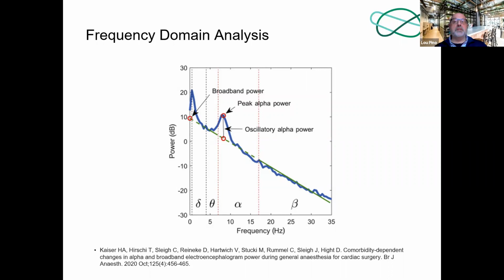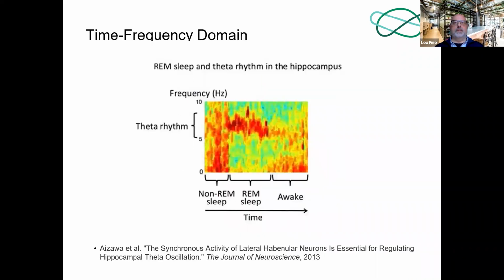So frequency domain analysis is very useful. However, a major drawback of frequency domain analysis is that temporal information gets lost when the FFT is computed. So that's why we prefer to use time and frequency domain. This is an example of features that capture both time and frequency. This is called the spectrogram.